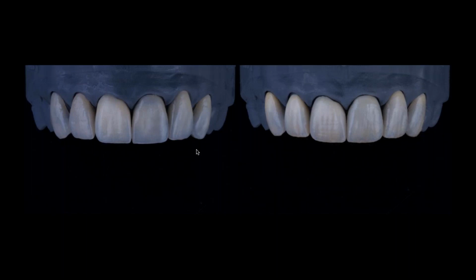So this is more of a high-end restoration, what we see on the left. And then on the right, this is the material with the technique of pressing, staining and glazing as a monolithic solution, which is also very reliable.